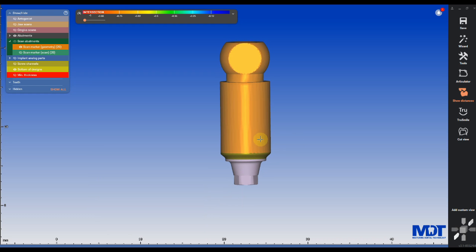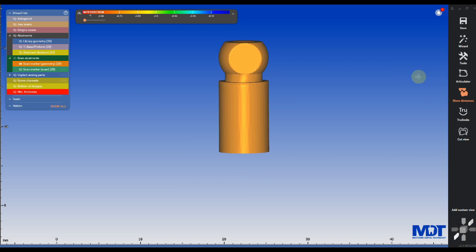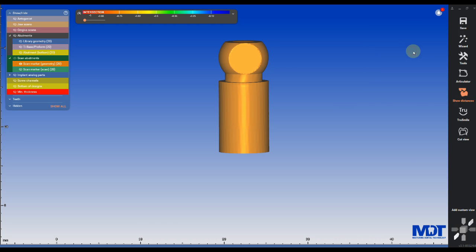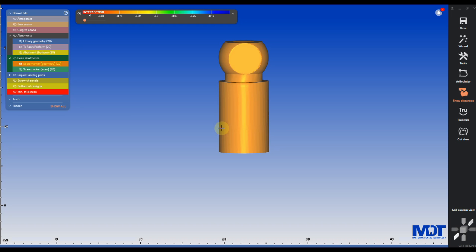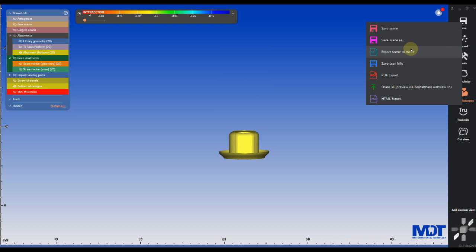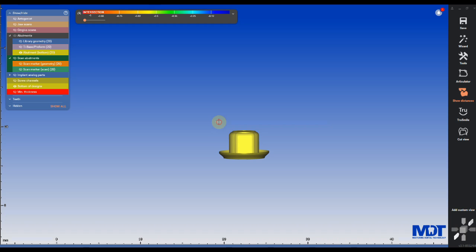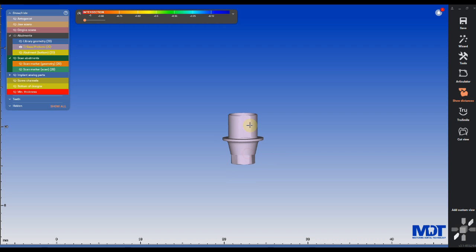In order to create our custom scan body, we need to export all three files separately. That means the scan body file we need to export as an STL, we need to export the bottom of the design separately as an STL file, and we need to export the actual tie base as a separate STL file that we can later import.